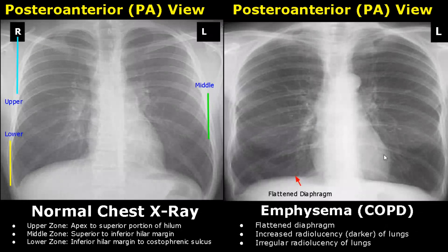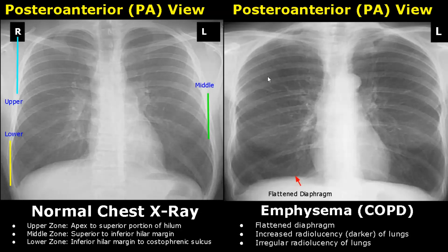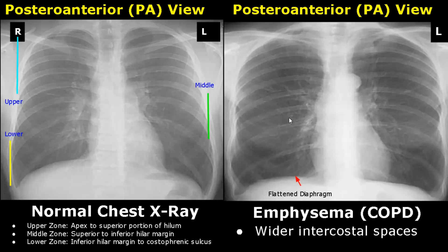Emphysema refers to abnormal permanent enlargement of air spaces. It is a component of COPD, which stands for chronic obstructive pulmonary disease — COPD patients suffer from chronic bronchitis and emphysema. On x-ray, the diaphragm will be flattened. The lungs are hyperinflated, making them appear darker than usual with increased and irregular radiolucency. We will also see wider intercostal spaces — the distance between the ribs has increased, which is another feature of emphysema.